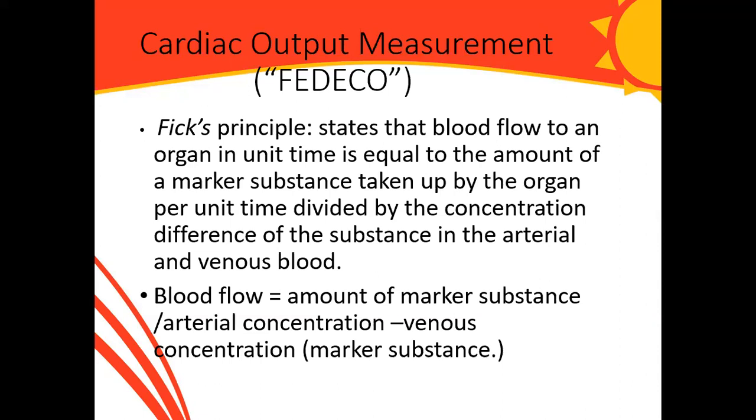This is used to measure the cardiac output in critical care settings where a marker substance is injected, you collect the mixed venous blood, and you're able to calculate the amount of substance that you injected over the arterial venous difference. That will show you the cardiac output.